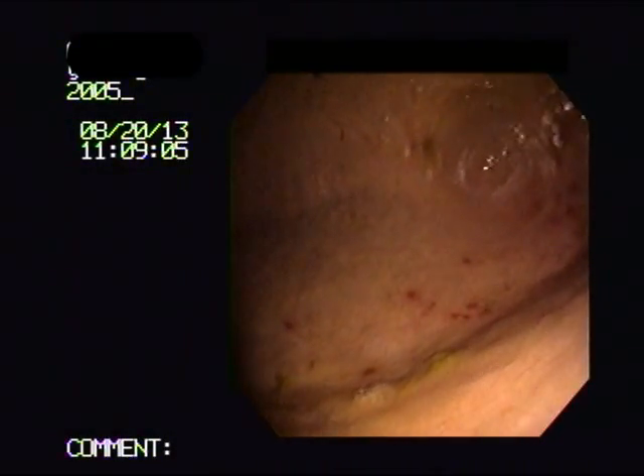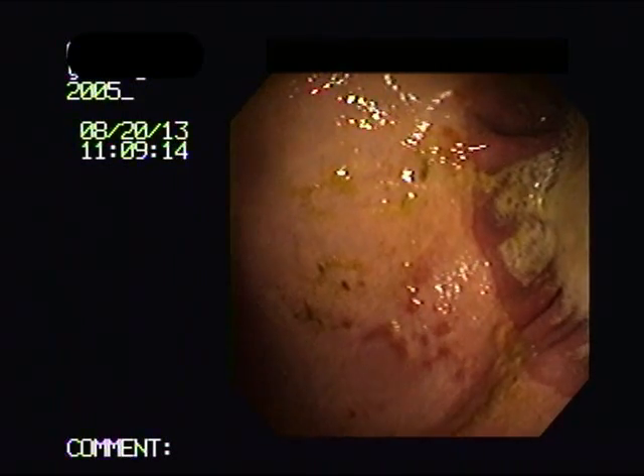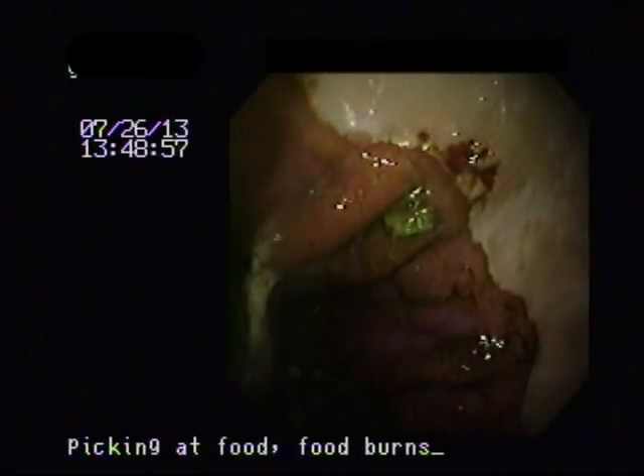Here are some examples of cases with stomach ulcers. This is a case of mild ulceration. We can see it on the squamous mucosa — the white part of the stomach — those little red knobbing or ulcerations. They are reasonably superficial.